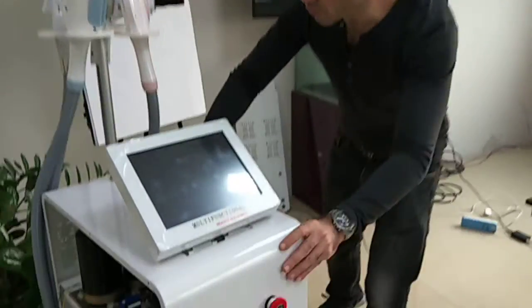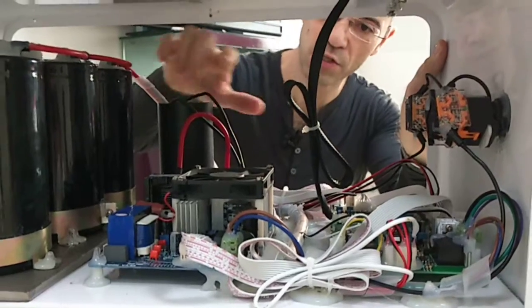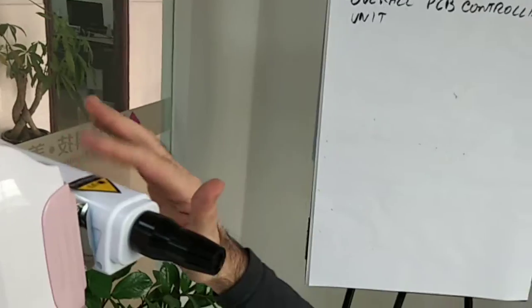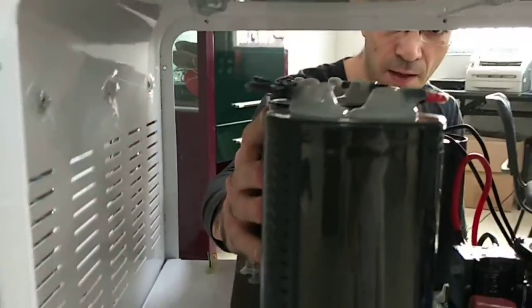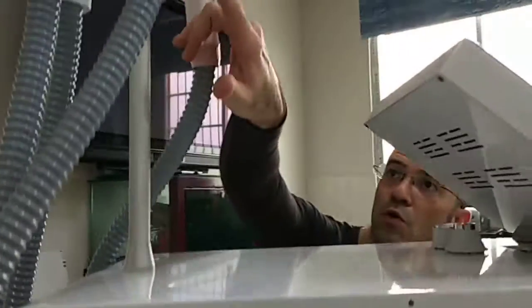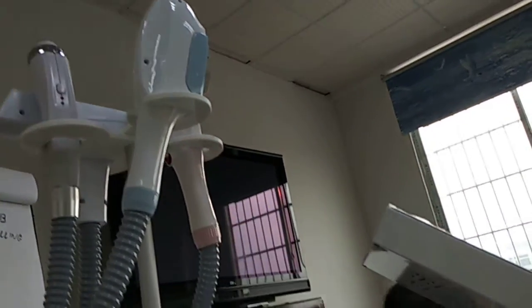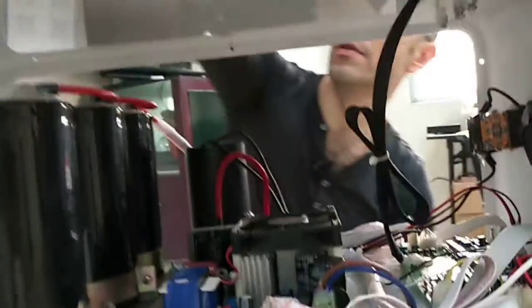Now, if we can actually go into this unit here. In here we've got the small capacitor, a 300 watt capacitor, which is controlled by this PCB, and this is for the Q-switch laser unit. Then we have the 3 big capacitors here, which are quite large because they are 2000 watts in power for these two heads here. One is for hair removal and the other for skin rejuvenation. This is the dedicated power supply to these 2 E-Lights.